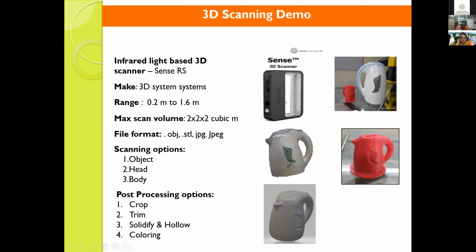It does not fulfill the need of dental, but it is useful for students because it is low cost, around 40,000. It will give students some idea of what 3D scanning is, how we scan, and what the different steps in scanning are. We are utilizing this, and even for making 3D selfies it helps a lot. It can scan, but because it is a manual process, taking the camera in your hand and scanning, there are some disturbances.